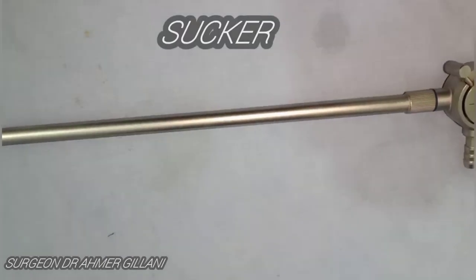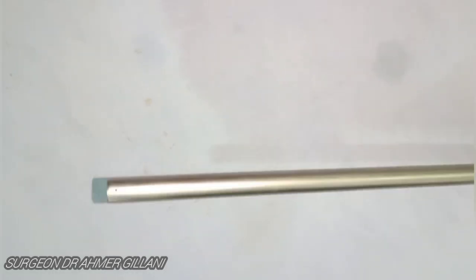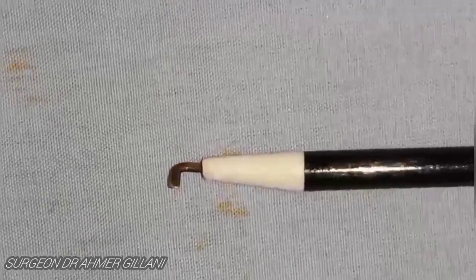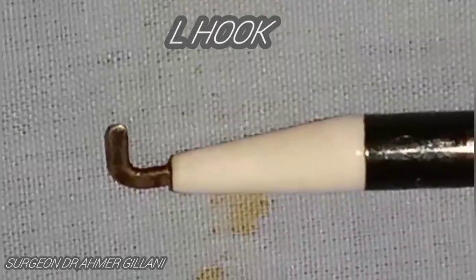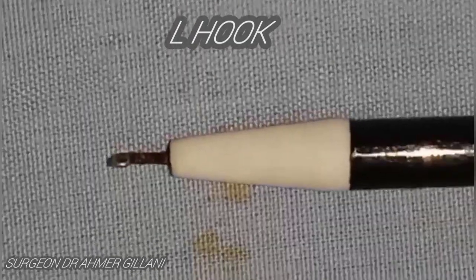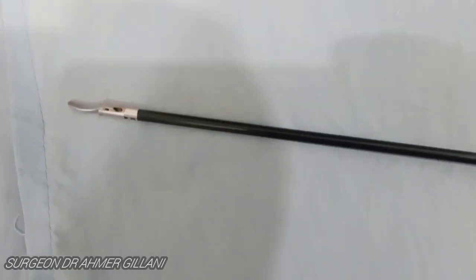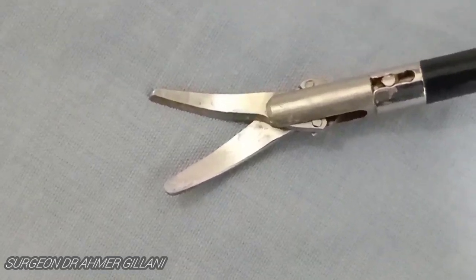The next instrument is basically the sucker nozzle used in laparoscopy to suck fluid when it is attached to the sucker. The next beautiful instrument on the screen is the laparoscopic L-hook, used in minimally invasive laparoscopic surgical procedures for coagulating, cauterizing, and other manipulation of tissues and vessels.